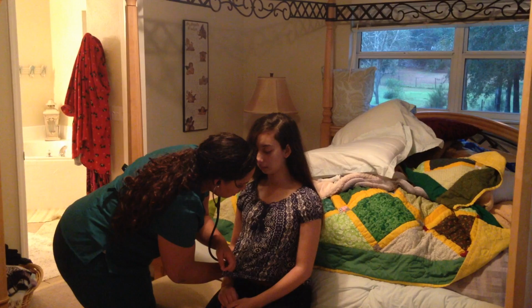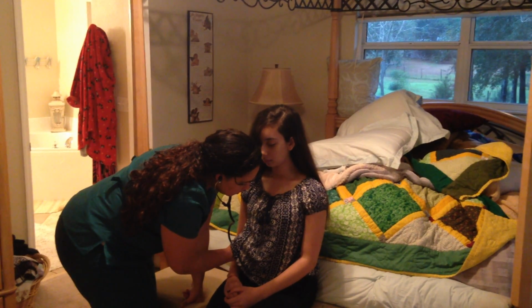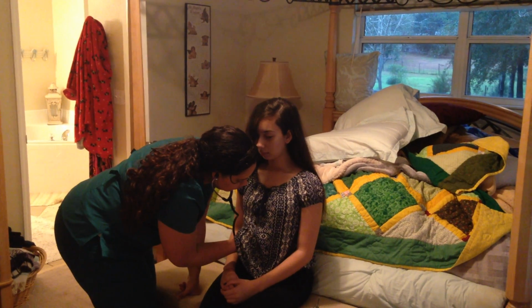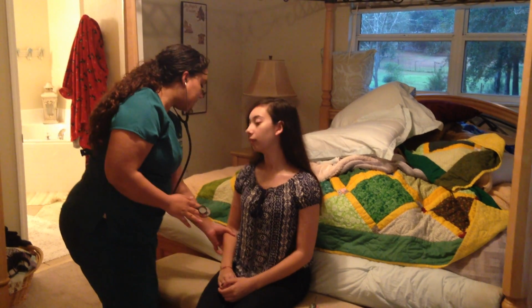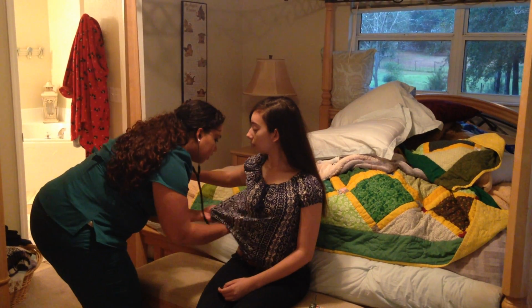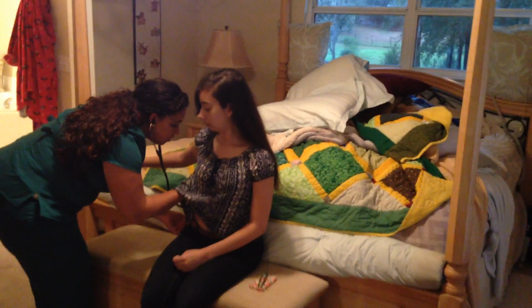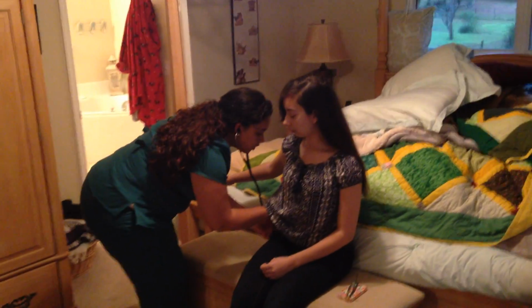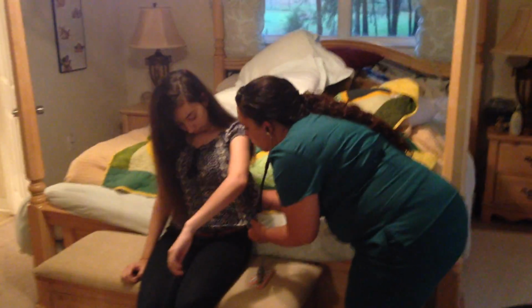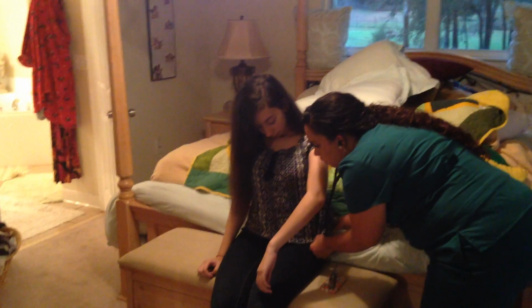Go under and listen. Deep breath. One more. Okay. Now I'm going to listen to the side over here. Deep breath. One more. Good. And this side. One more.